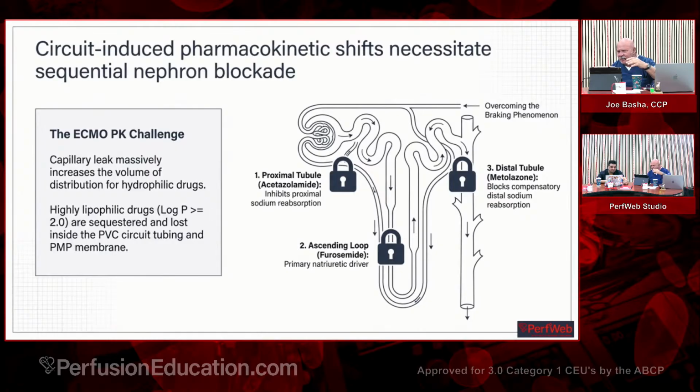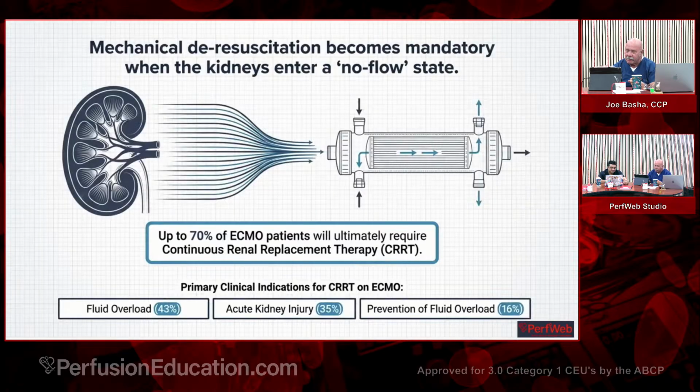Very much so. And then you have to remember that once this becomes saturated, if you're going to keep that oxygenator on, you need to be coming down on those drugs. But what's really important is when you have to change it, you have to tell them, because you're going to be giving that same amount and the patient's going to see nearly none of it, because it's all going to stick until it becomes saturated again. Yep. Very important. Volume of distribution of medications is extreme. And third spacing has the same effect.